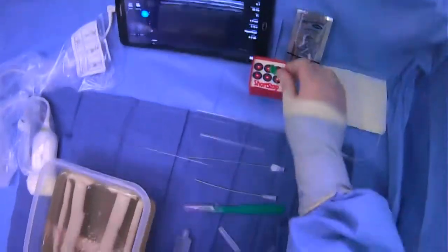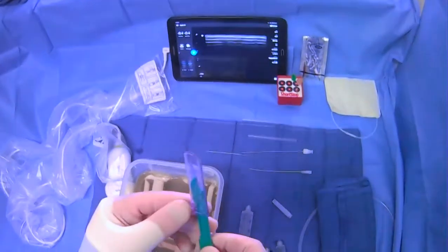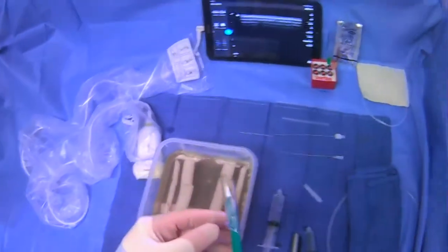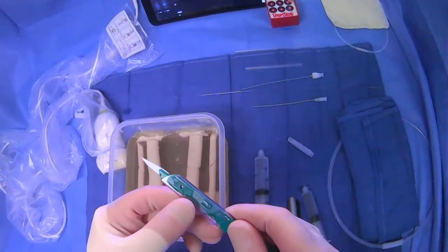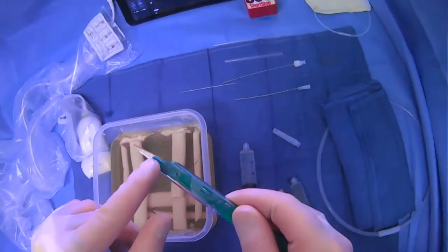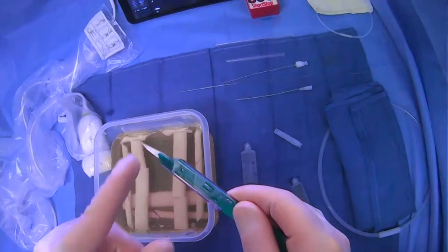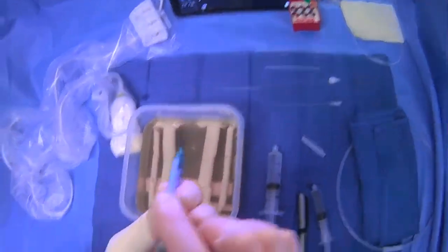Then we're going to take our scalpel and make a little dermatotomy. We can let that wheel work a little bit, but as that local anesthesia is working, just look at the blade. The sharp side is on this side, so that's what we're going to point away from us.